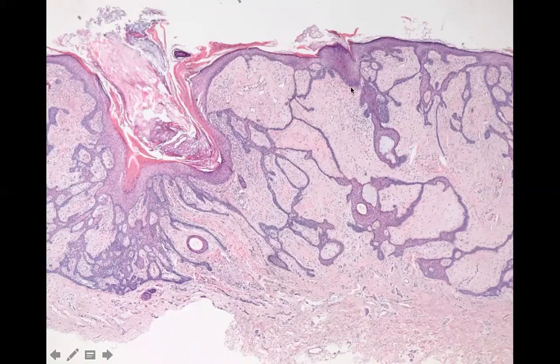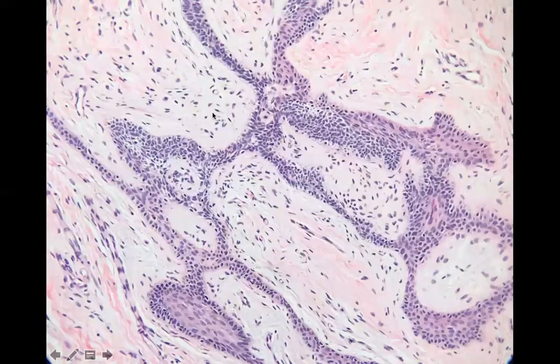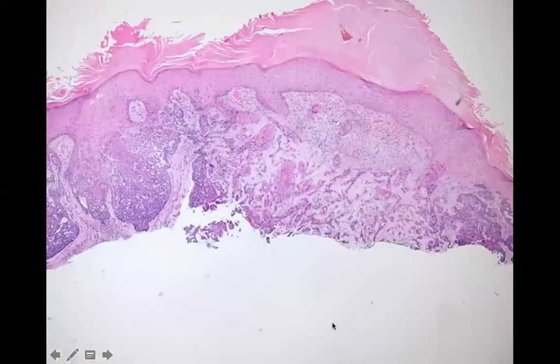These are sort of papular, sometimes taggy lesions on the back usually, but you have these elongated areas of basaloid cells and they bear the same stroma as basal cell carcinoma. So you'll see this fibromyxoid stroma surrounding it. And we're going to see later in the adnexal neoplasm, when you're talking about follicular adnexal neoplasm, the stroma is different. So I think clinically and histopathologically, that's where the line is drawn.